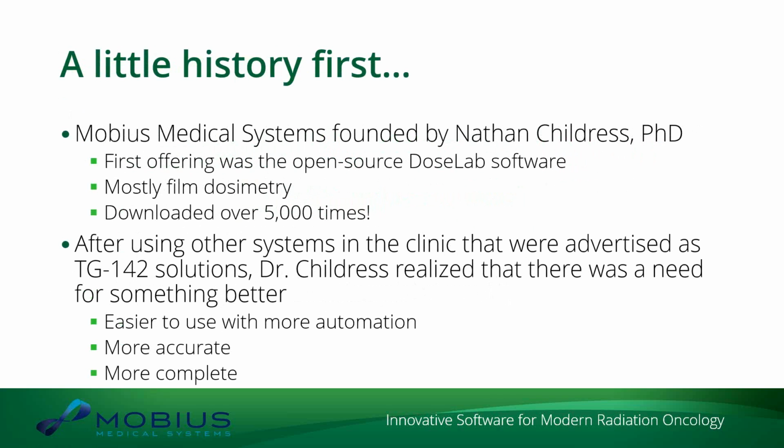What he wanted was something much easier to use, with a lot more automation, because time-consuming work is a real detriment to medical physicists nowadays. Anything that can speed things up is better. He wanted something more accurate, as he found a lot of accuracy issues with what he was working with. And he also wanted something more complete.